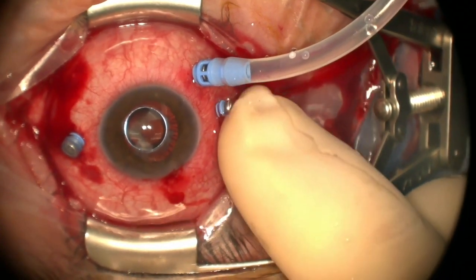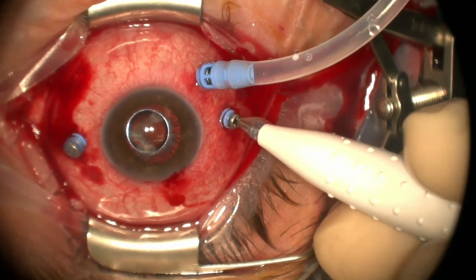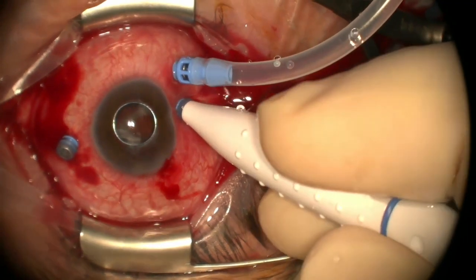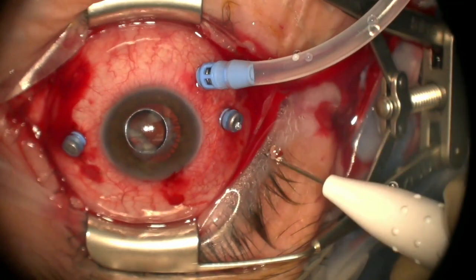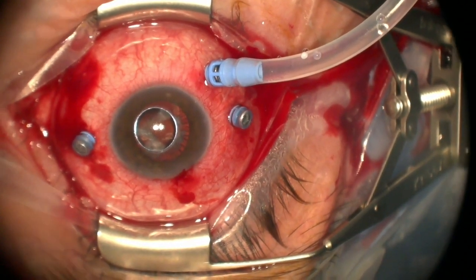I don't mind letting this run a little bit. Yeah, great. Okay, great. So we got our little valve there. And we're going to just push it back on. Very nice. Well, that was clever. So we got the valve back on.